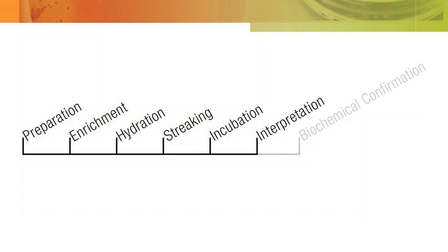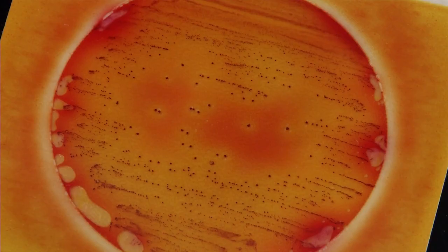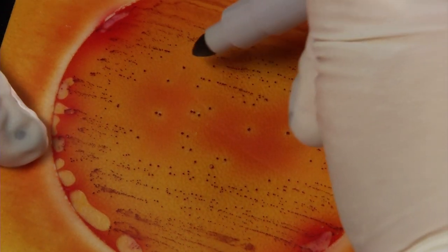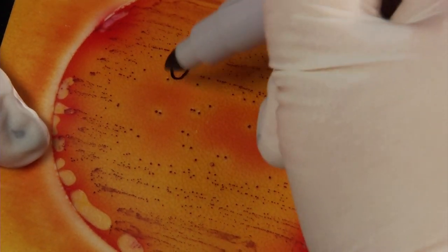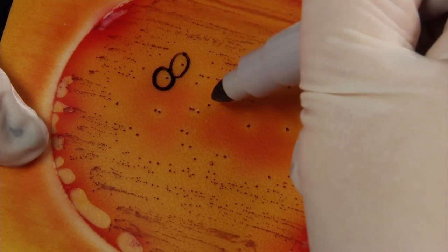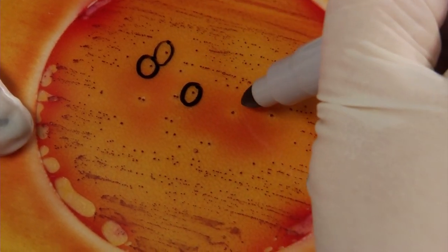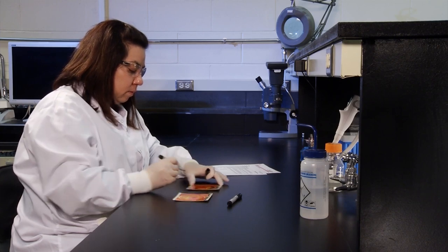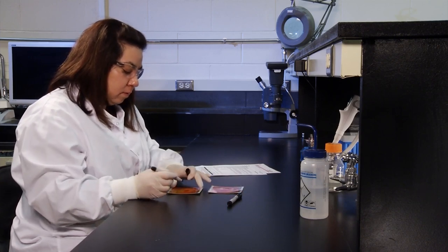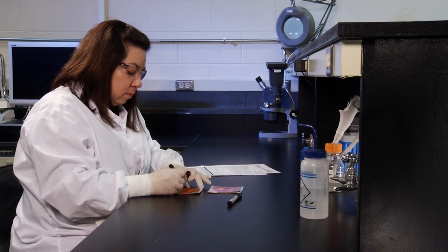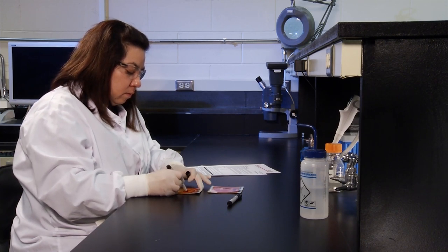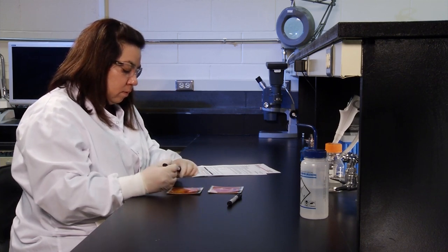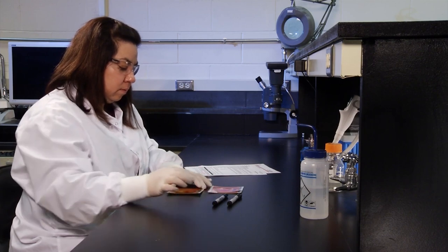If you have found presumptive positive salmonella colonies, perform the following steps. First, take out a permanent ultrafine tip marker and circle a minimum of five isolated presumptive positive salmonella colonies on the top film. Second, biochemically confirm all circled salmonella presumptive positive results using the 3M PetriFilm Salmonella Express Confirmation Disc.